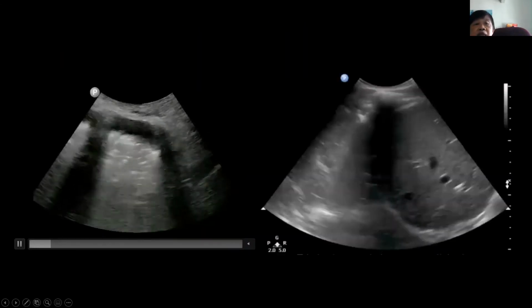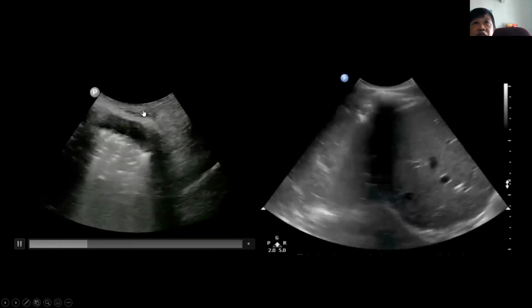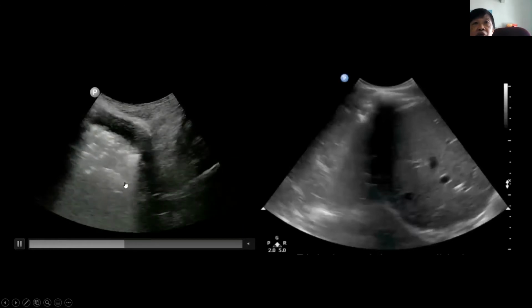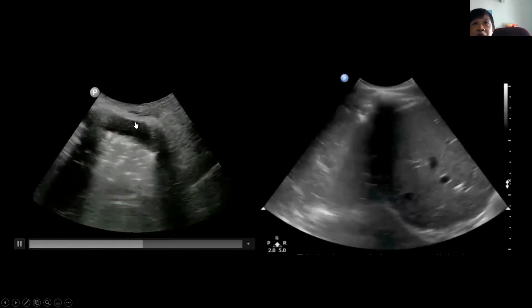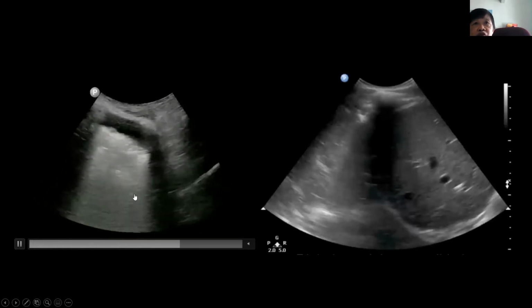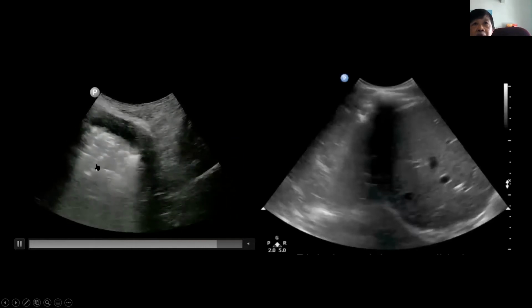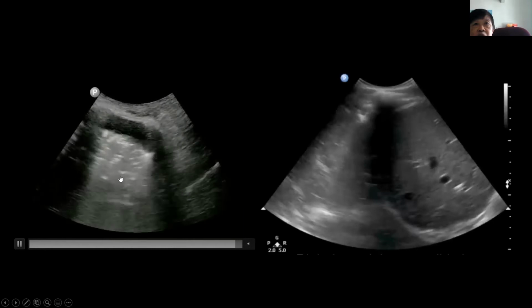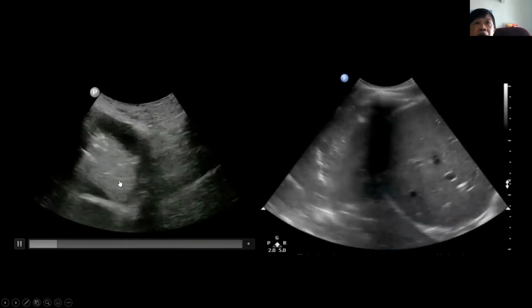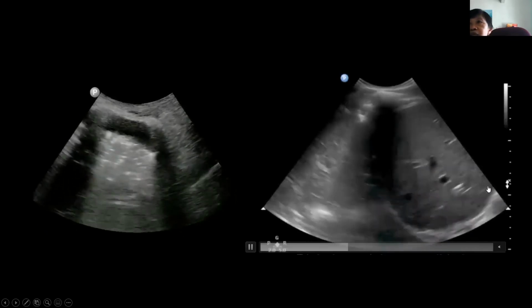Okay, so this is a slide of ultrasound of the patient being kept in the prone position. This is the chest wall, and here is a big sort of collapsed structure with some pleural effusion. What is black is always pleural fluid, and here you can see within this structure, you can see air bronchogram, which gives it a starry sky appearance. So it can either be dynamic or static. Some of it, this part looks static, but you want to see dynamic, which is better seen in this.